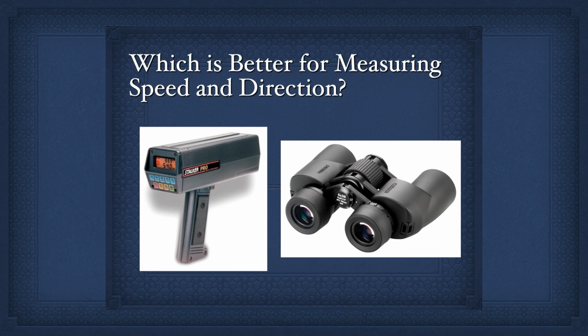There's too many ways that the Doppler gun can have errors in it. You can miss the target. You can be getting the reading off something else. If my life was bet on if that tiger was running at me or not, I would pick the binoculars, and that's my logic with single detector OCT.